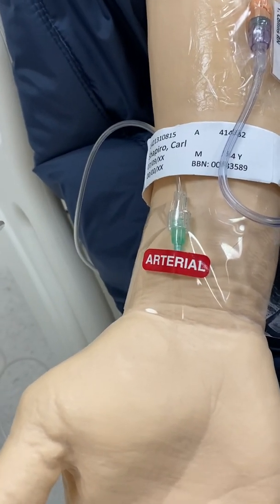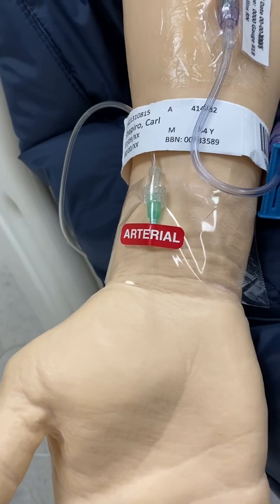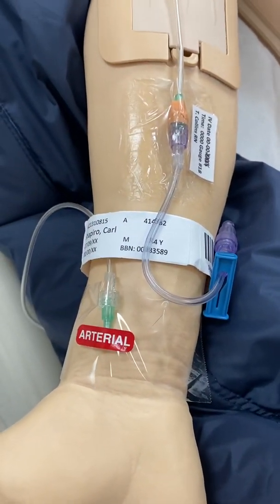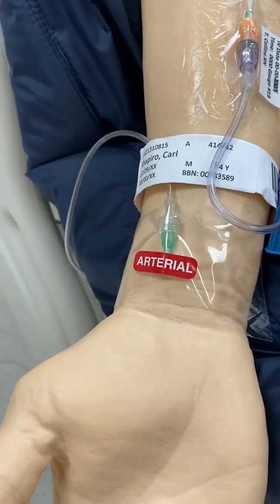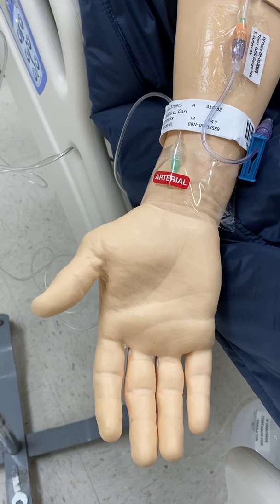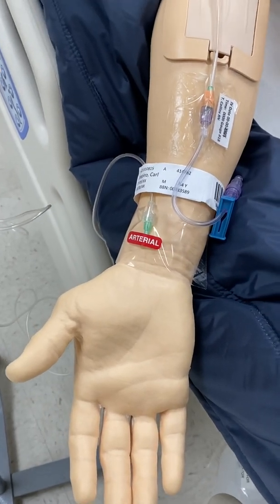Y'all need to be sure and thank Miss Zerbel. She did a lot of work. So here he's got an arterial line in his right radial. What will be priority assessments because of that arterial line?